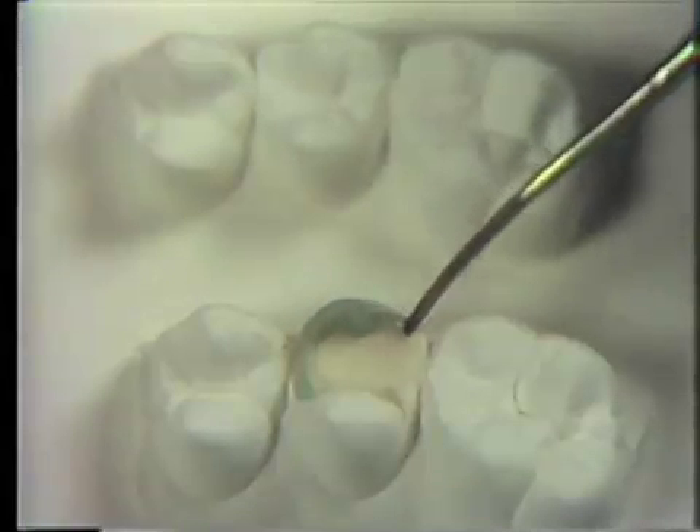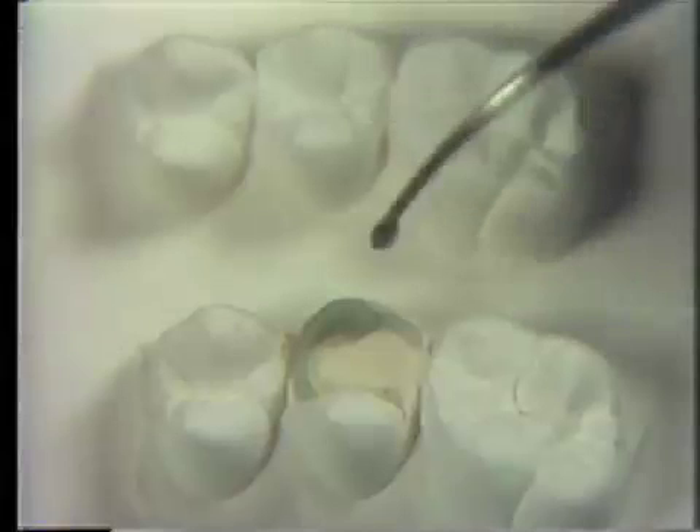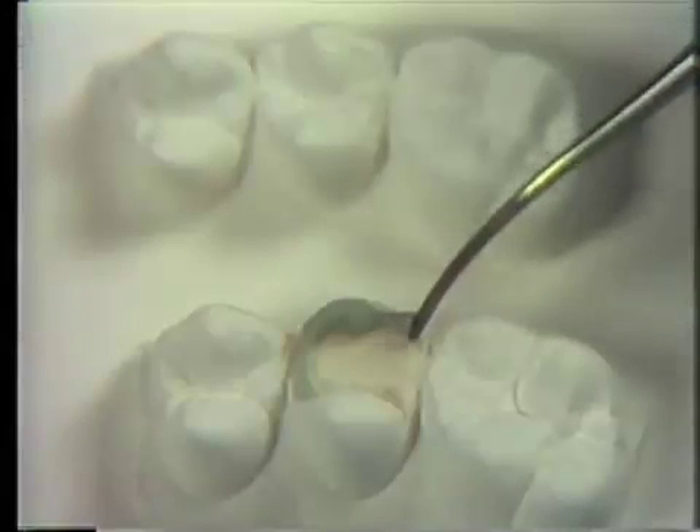The same is repeated distally. Note the squareness to the labial surface. Keep referring back to the replica above for its precise shape.